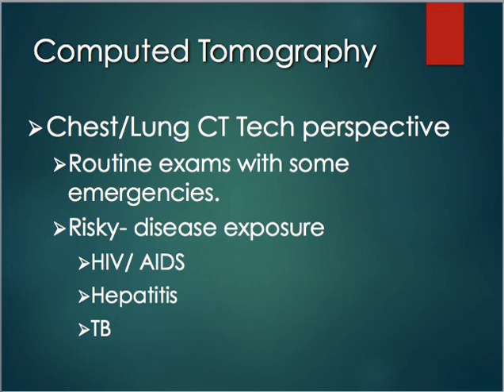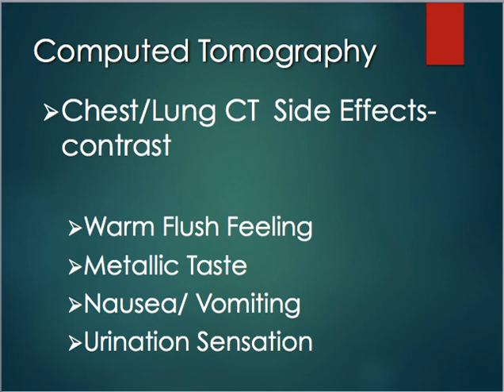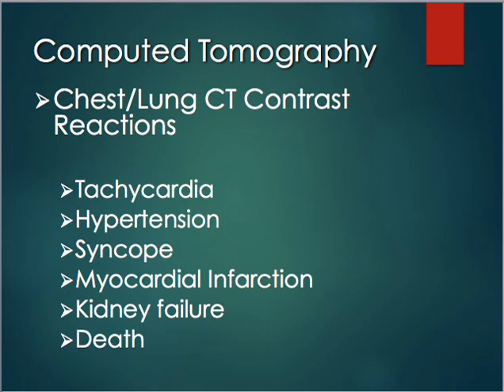The tech perspective, again, is they're going to be pretty routine exams. There's going to be some emergencies, especially with trauma, MVA, pulmonary embolisms, things like that. Again, anytime we start an IV, there is the risk for HIV, AIDS, hepatitis. When we're dealing with the lungs and chest, it could again put us at risk for things like tuberculosis. Side effects are going to be the exact same anytime we administer any contrast. And again, you're going to have the same possible reactions: tachycardia, hypertension, syncope, myocardial infarction, kidney failure, or death.